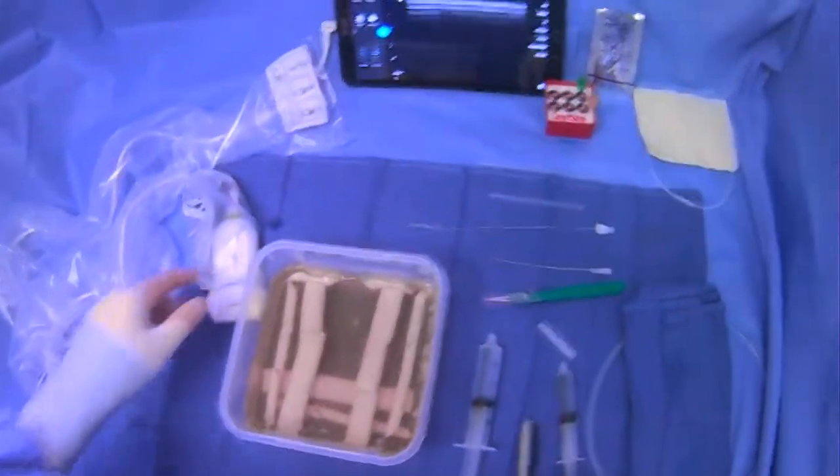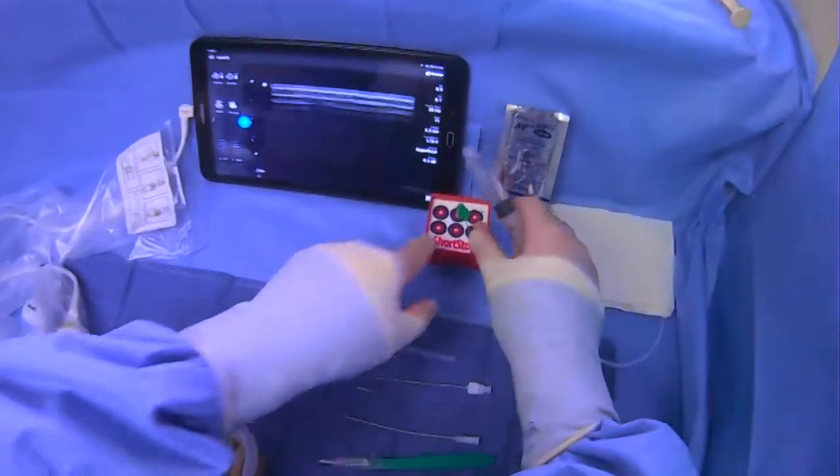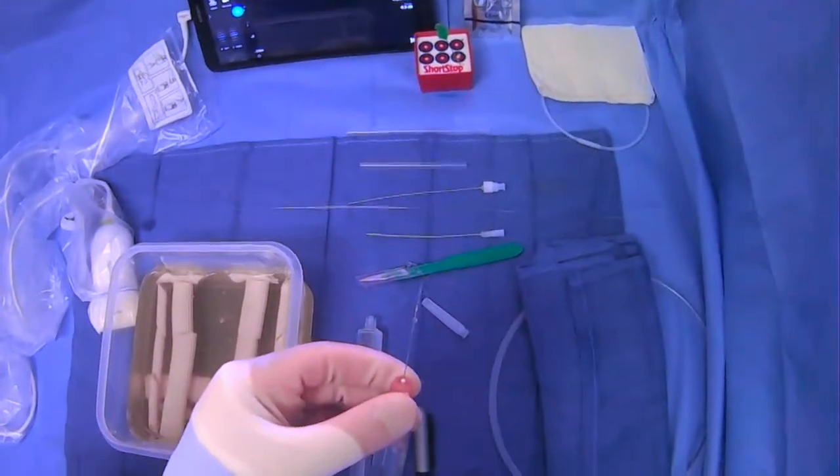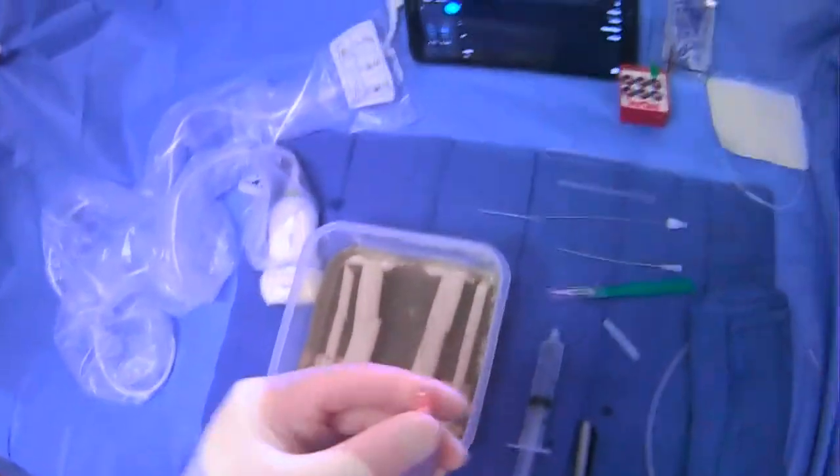Once we have our mark in the skin, we can put the probe down, then we can grab our lidocaine. We're going to use a 25-gauge needle here with a little bevel tip, bevel up.